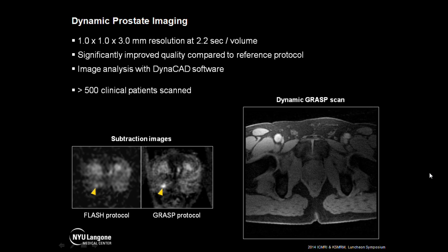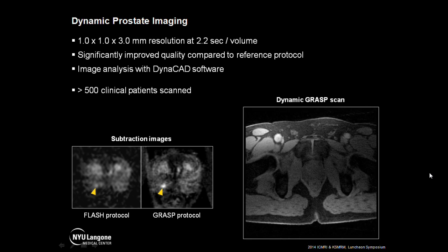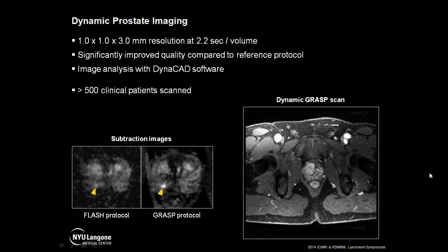And on the right side, you can see how these dynamic GRASP prostate scans look. Compared to our previous dynamic prostate protocol, this is a significant improvement in image quality and spatial resolution. And you can see this in these subtraction images shown on the left side.